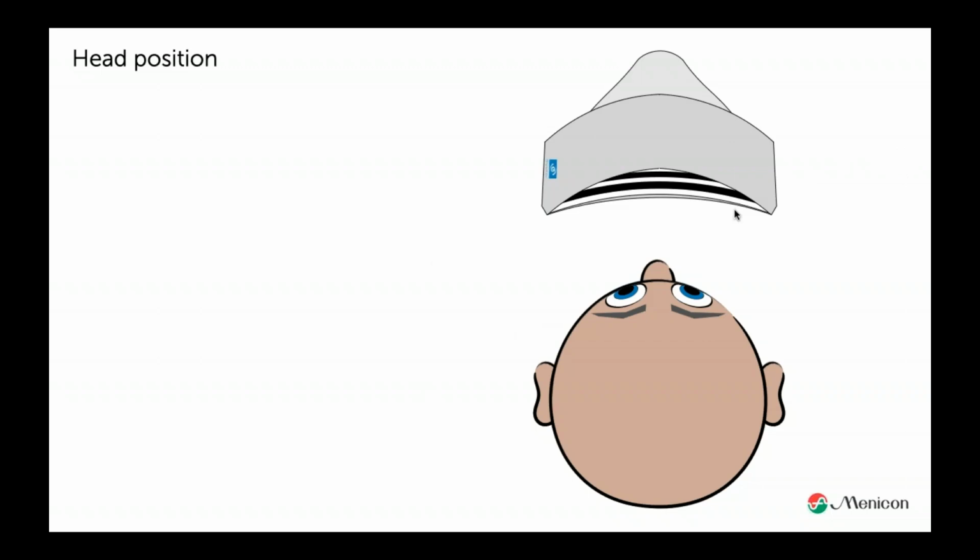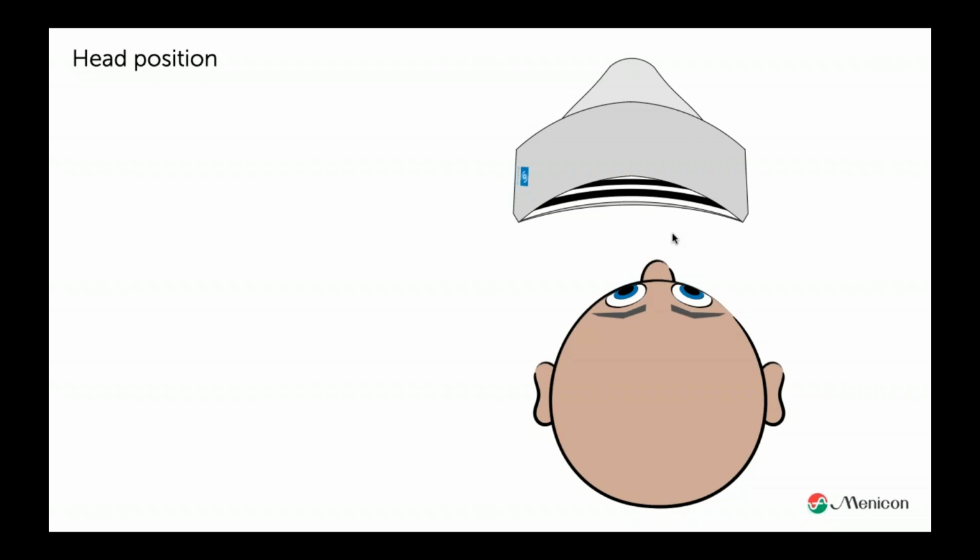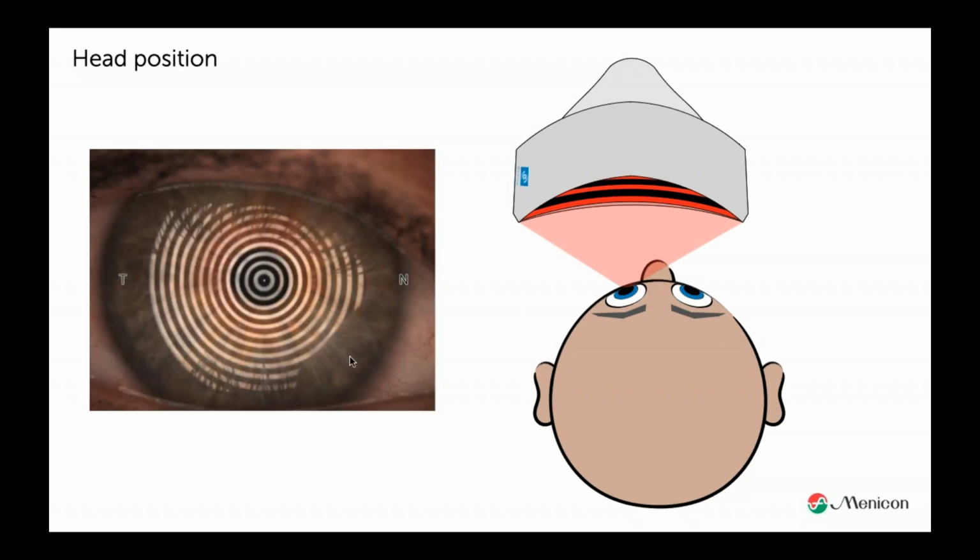What we have, and I mostly talk about the larger cones, the majority of the topographers out there with larger cones. Be aware that if you measure the left eye and you put it on, the nose can be in the way. So if that's the situation, you will end up with the nose missing. And we can argue and discuss about the superior part. If you have an eye that is too deep in the orbit, there is no way to get the superior part. But the nasal part is something you can always measure.